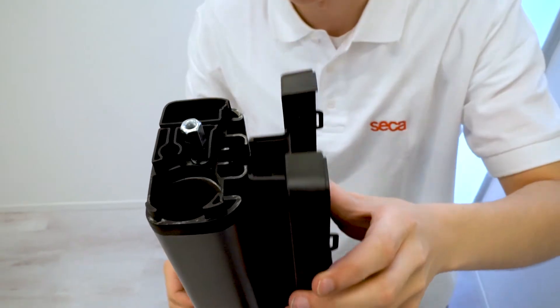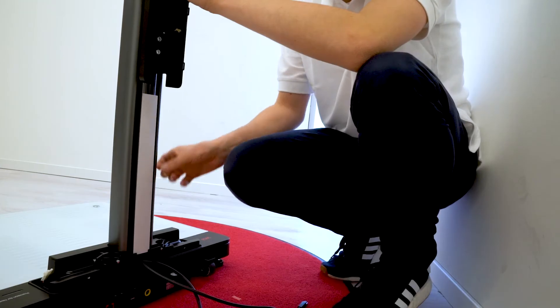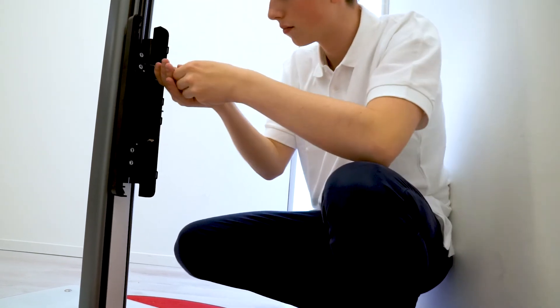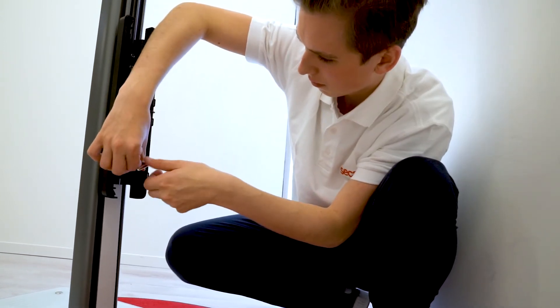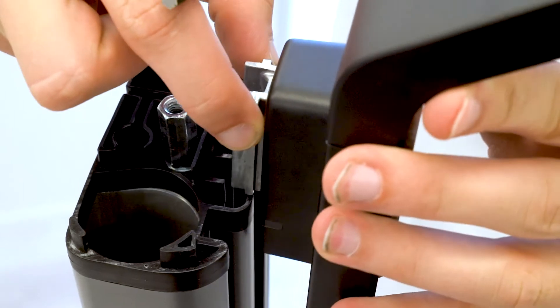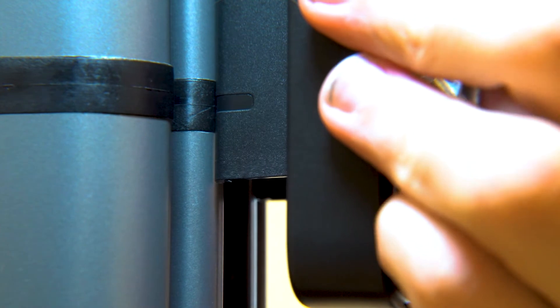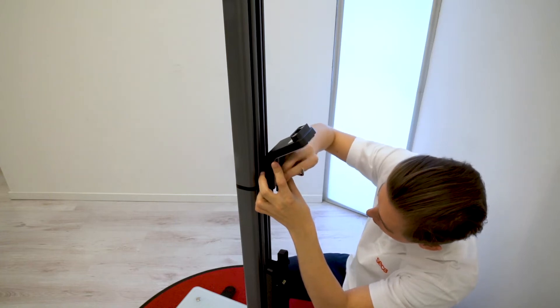Slide the BIA box into the duct until it reaches the assembly aid at the bottom. Rest the cardboard assembly aid on the base of the mounting duct — this is the proper height for mounting the BIA box. Fix the box in position by tightening the four screws with the 5 mm Allen key and remove the assembly aid. Next, slide the handrail connector down the mounting duct. Position the connector such that the marks on the connector line up with the center of the profile connector between the base and the center column segment. Tighten the two screws with the 5 mm Allen key.